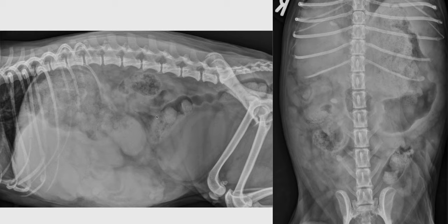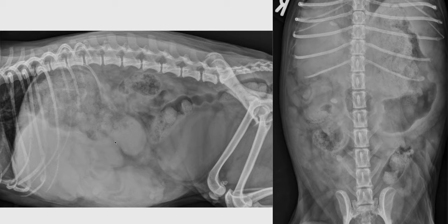Now I will highlight the most significant findings on those abdominal radiographs. The most striking thing on those radiographs is the displacement of the gastric axis. Normally, when we trace the gastric axis between the fundus region of the stomach and the pyloric antrum, this gastric axis should be roughly parallel to the ribs or perpendicular to the spine in more deep-chested dogs.